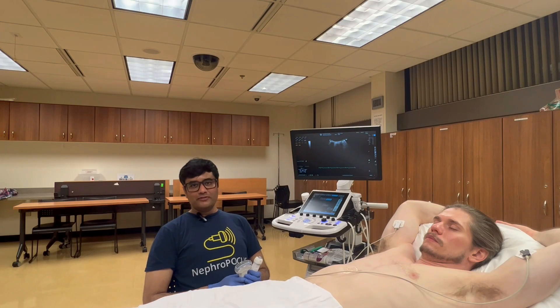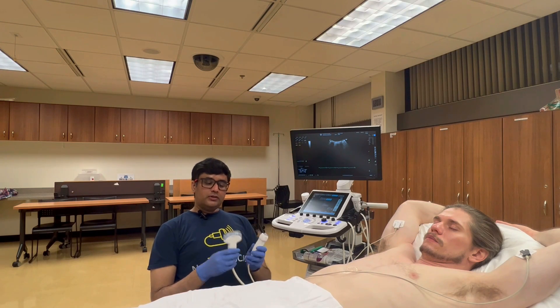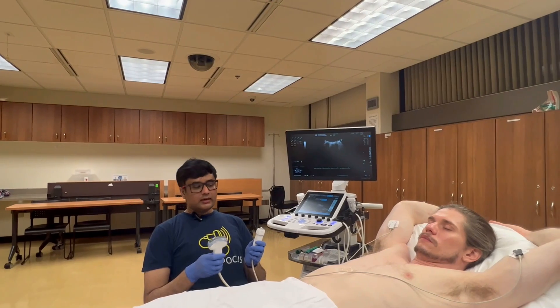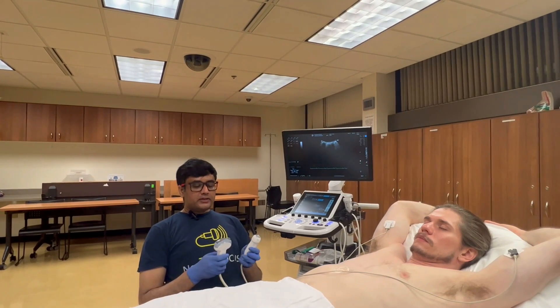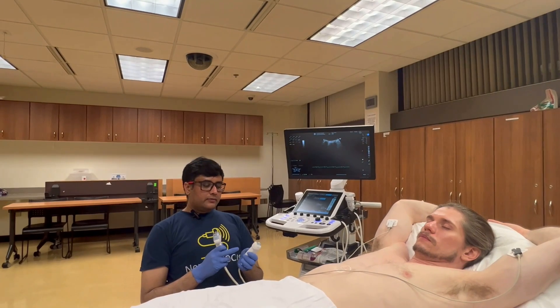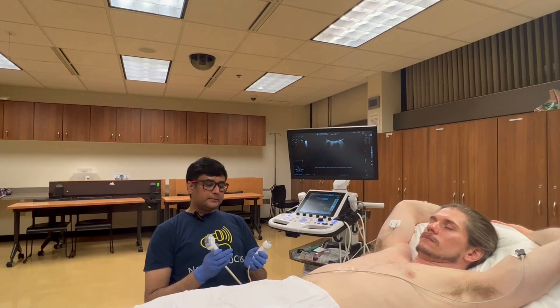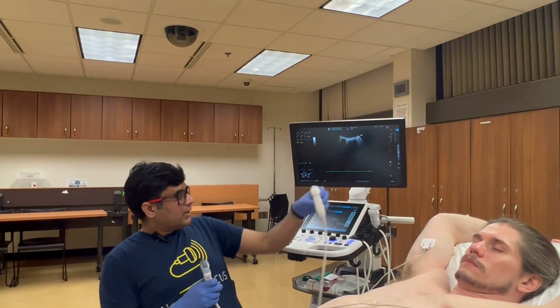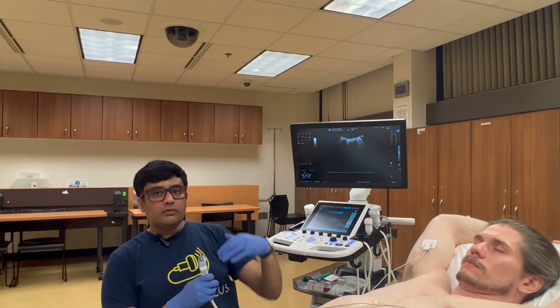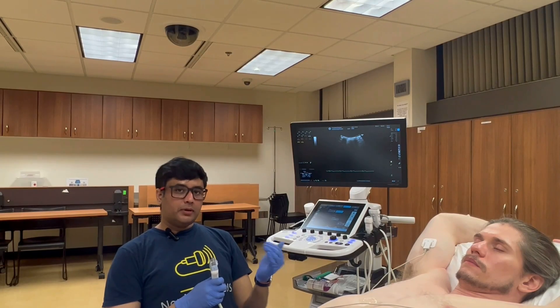Hi, this is Nephropocus. Let's do a VExUS scan. To do a VExUS, you can use either a phased array transducer or a curvilinear transducer. I generally prefer the curvilinear transducer because we are scanning the abdomen, and phased array settings are more optimized for cardiac scanning. When doing Doppler, you might have to adjust settings such as scale and wall filters to suit abdominal scanning.